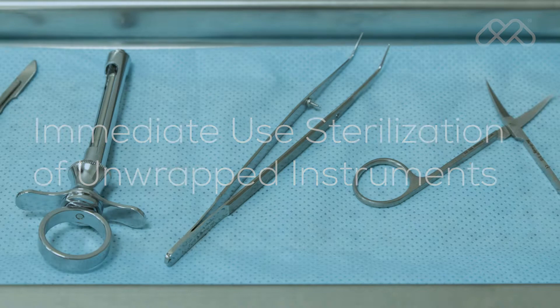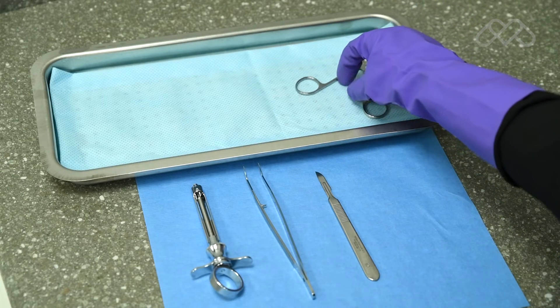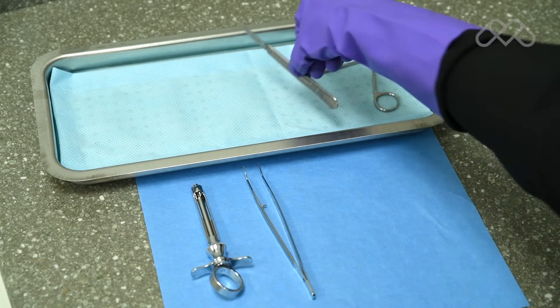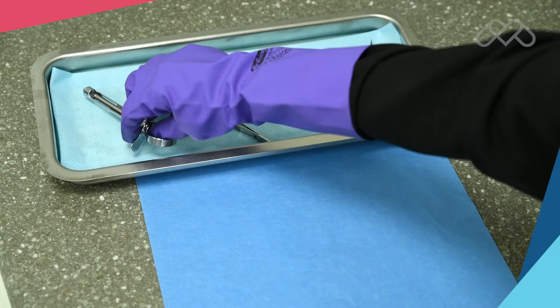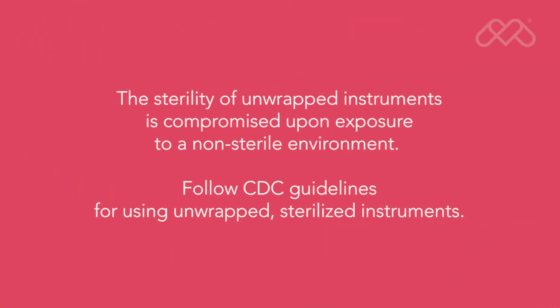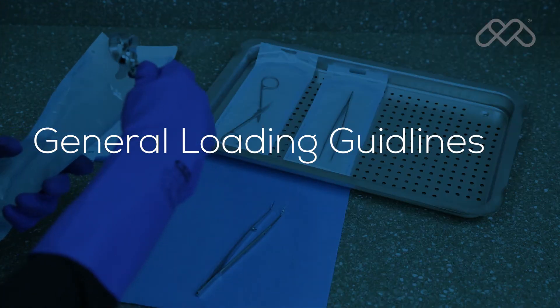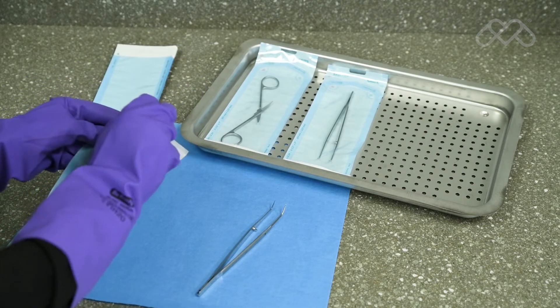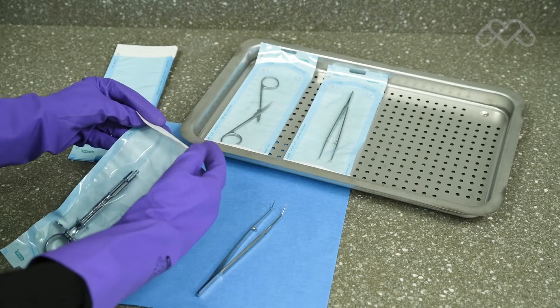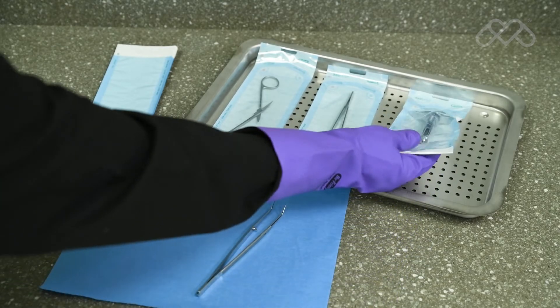M9 and M11 steam sterilizers are capable of sterilizing unwrapped instruments for immediate use. Place a surgical cotton towel, paper tray liner, or a folded CSR wrap in the bottom of the tray, and arrange the unwrapped items on the towel so they do not touch one another. The sterility of unwrapped instruments is compromised upon exposure to a non-sterile environment, so follow CDC guidelines for using unwrapped sterilized instruments.